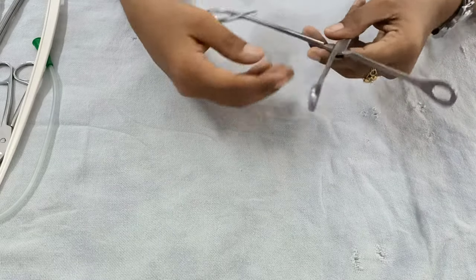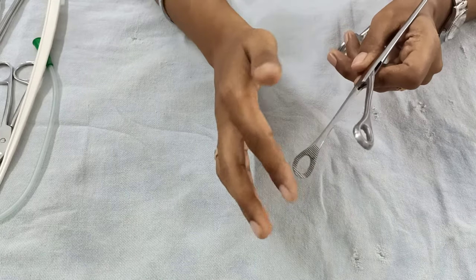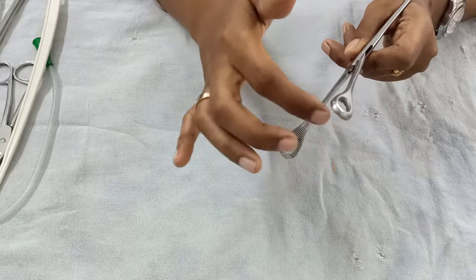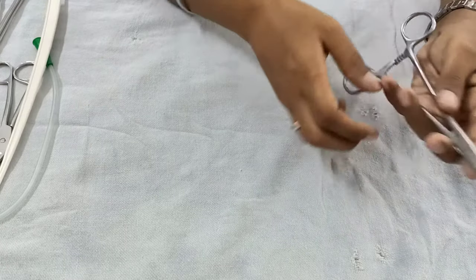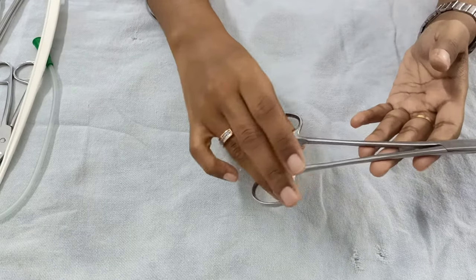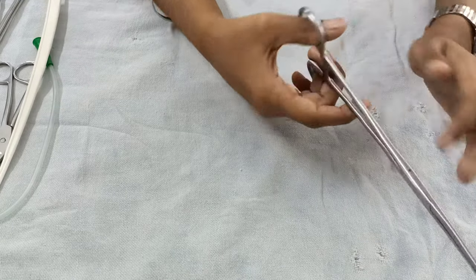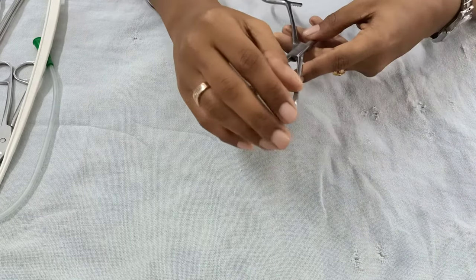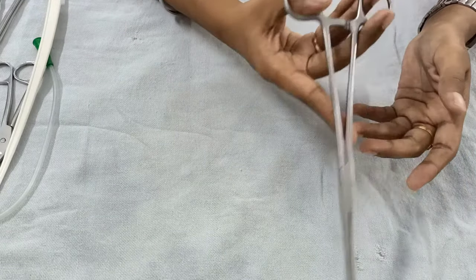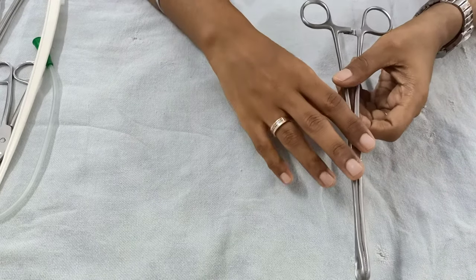This is a sponge holding forceps. In the distal part it has two rings, and inside these rings there are transverse serrations. At the proximal end you can see there is a locking system, so you can grasp your swab, lock it, and clean the perineum of the patient.